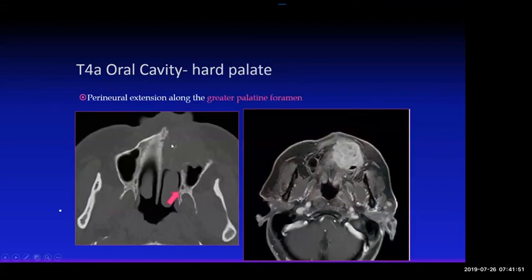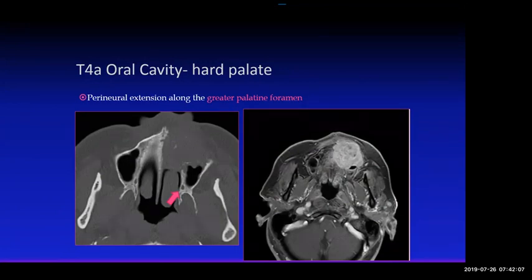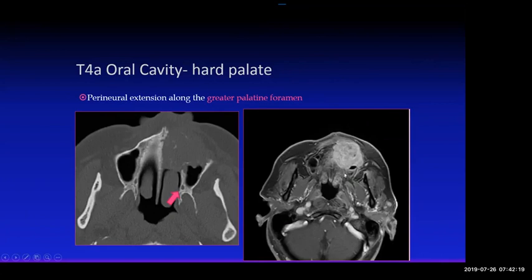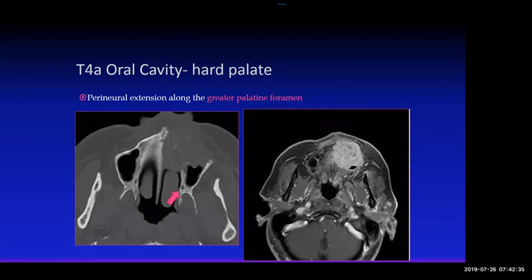This is a very extensive locally advanced tumor of the hard palate on the left. Look for extension of tumor along the greater palatine foramen — on the left side the foramen is slightly larger than the right, which is indicative of perineural spread of cancer. This is something the surgeon will never see, so it's our responsibility to point it out. On MRI there's enhancement along the greater palatine nerve. The radiation oncologist will follow this up to see if enhancement extends to the skull base and include that in their radiation field.